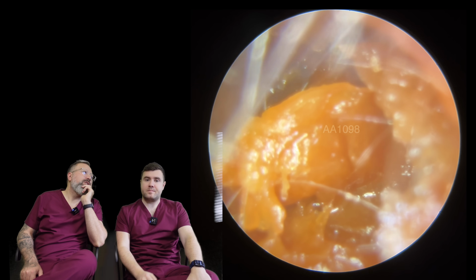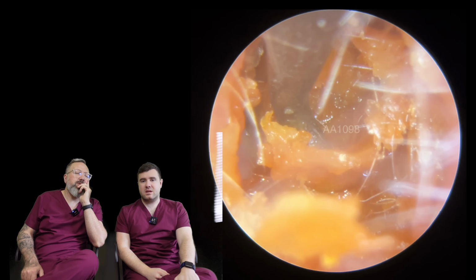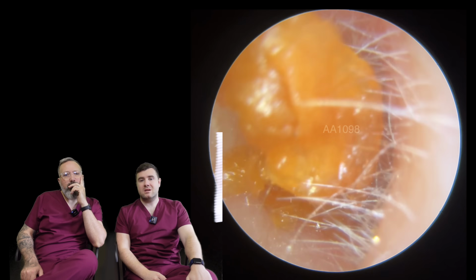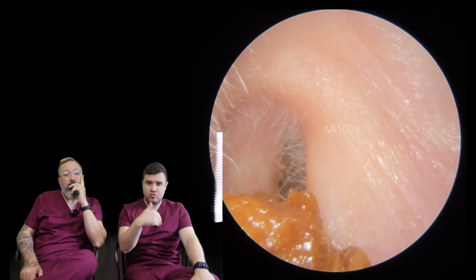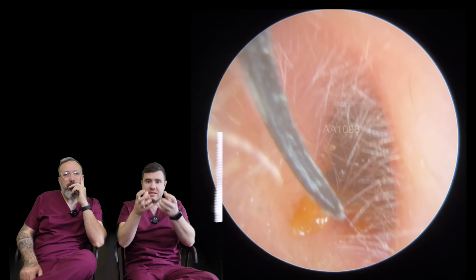Would you opt more for irrigation at that point then, over suction? It depends on what the consistency is, I suppose. Yeah, I was just going to say, I think it really depends on the consistency. So luckily, as we're starting to draw some of this forwards, it is slowly bringing that deeper section forward.